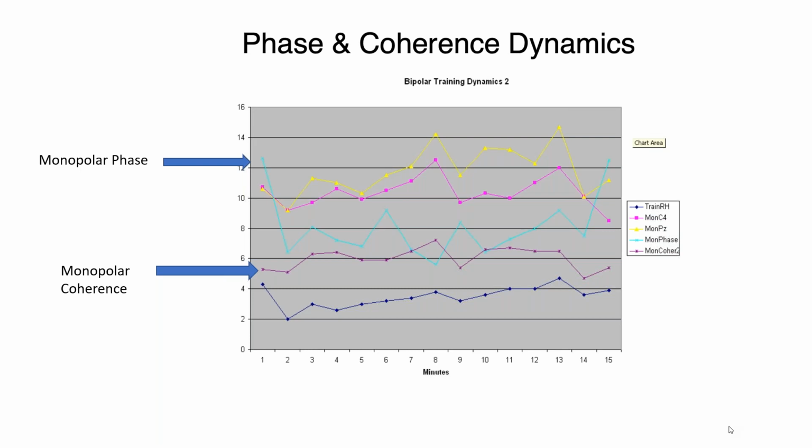And as Van der Kolk says, his theory as a psychiatrist is that you get somebody into that really calm zone, and they can very quickly integrate trauma, but you have to be able to get them into it. What I like about the alpha theta is you can usually see clearly a signature when they're in there and how long they're in there. I'm not sure that's as clear using the bipolar montage, but you might be able to make arguments that you could. I think you tend to use the toolbox you're most familiar with.